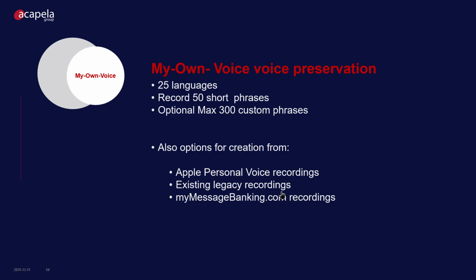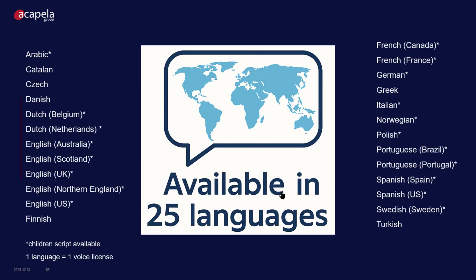And also, if people have used mymessagebanking.com to record phrases, these recordings can be used to generate a My Own Voice as well.